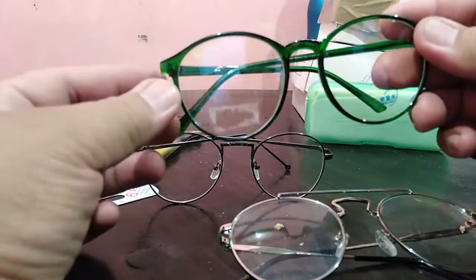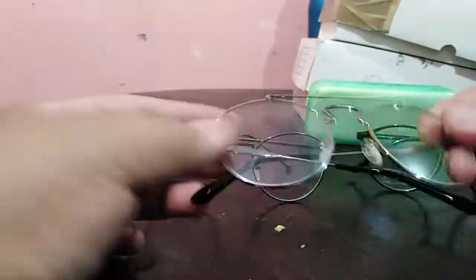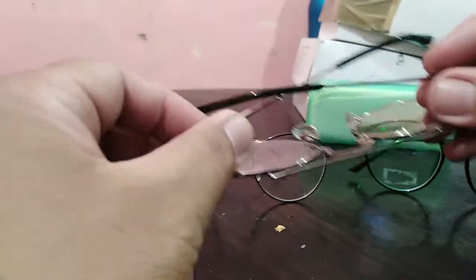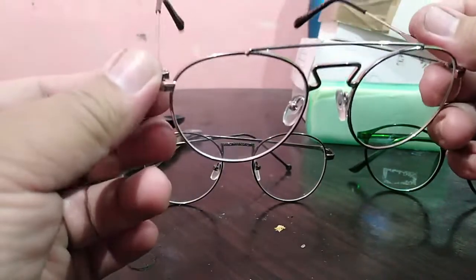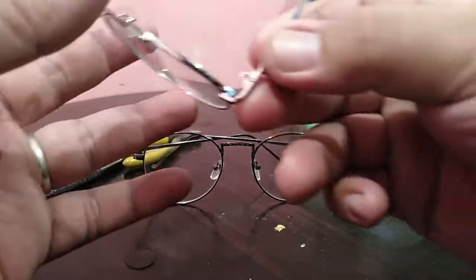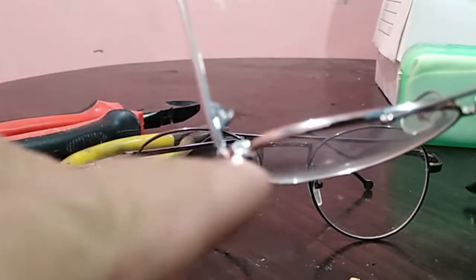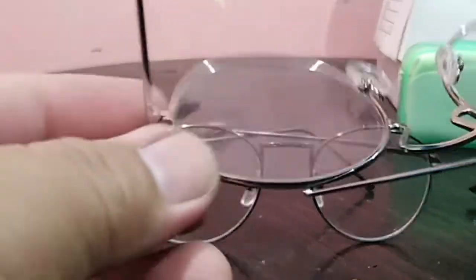We have a round metal frame and also a round plastic frame. For example, this metal frame has no opener — no screws here — so you can't open it, unlike this other frame.